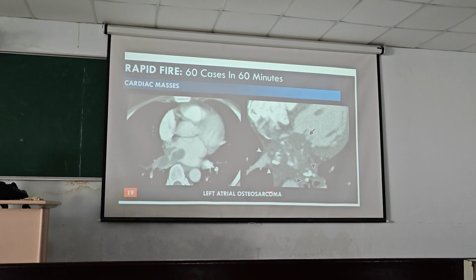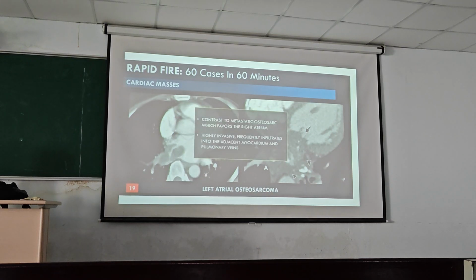So because of the amorphous calcification, you have to think of osteosarcoma, and it can occur in the heart. It's very rare.